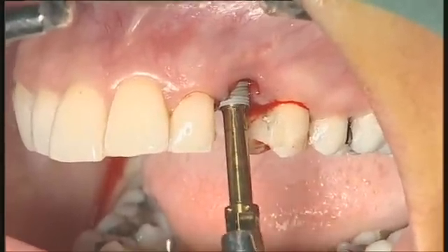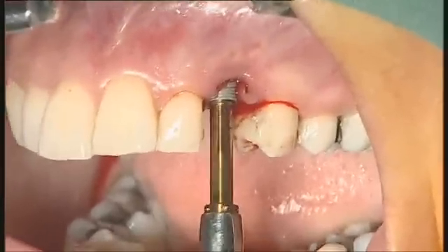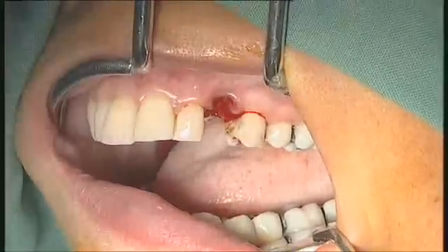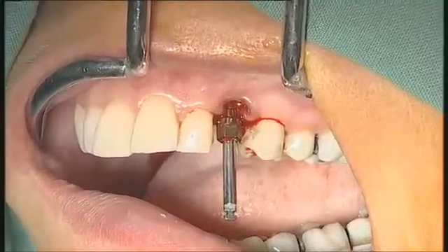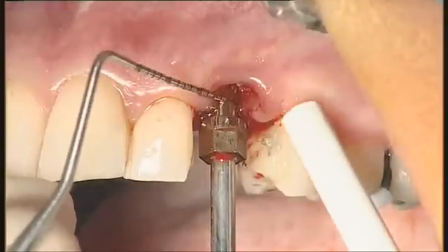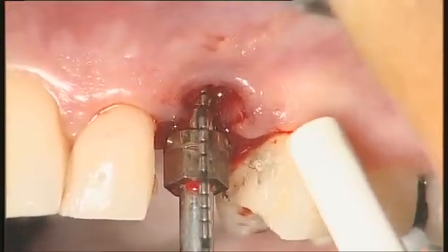At the moment my torque is still quite high, so I will come back slightly just to decrease the pressure — I don't like having too much pressure. This is the position we want. On the implant driver, we have an indication of a distance of 3 mm between this line and the implant top, and I would like to rebuild the gingiva to that point.